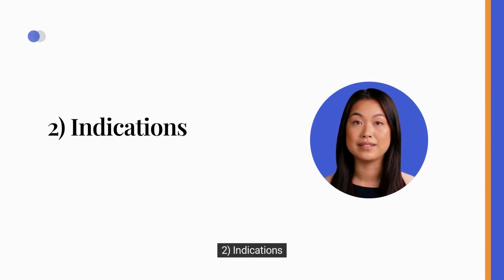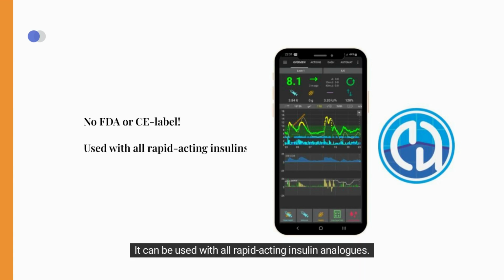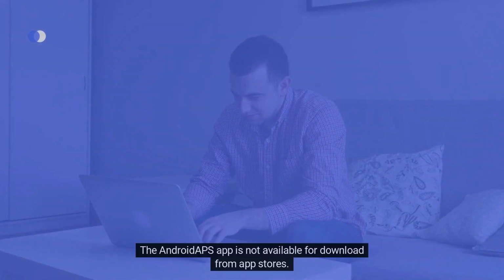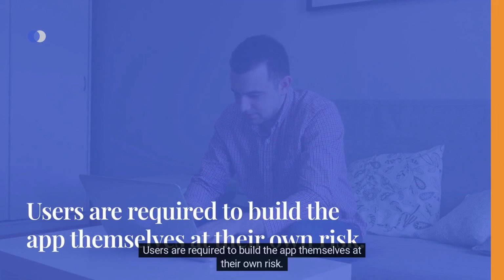2. Indications. AndroidAPS is an open-source app that does not have official indications approved by the FDA or European authorities. It can be used with all rapid-acting insulin analogs. The AndroidAPS app is not available for download from app stores. Users are required to build the app themselves at their own risk.